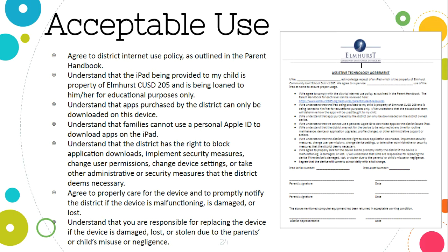This is our voice. You understand that the apps purchased by the district are the only apps that can be downloaded on the device. So right now, we've got TouchChat on there, which is the app that your child's using. All of the other apps that are available to kindergarten and first graders are also on there. I don't have a way to not have those show up. We've tried it and it hasn't quite worked. So right now I have them all dropped in a folder. It usually just says Elmhurst stuff and it's just those apps. But again, we're not using those right now. We just want your child using that TouchChat app.